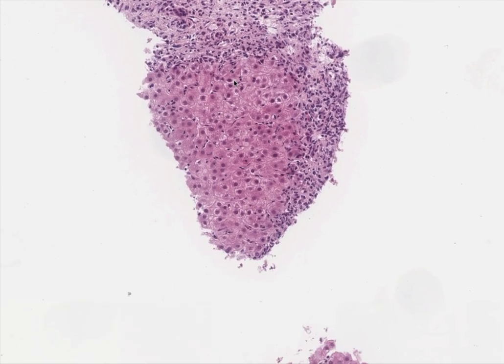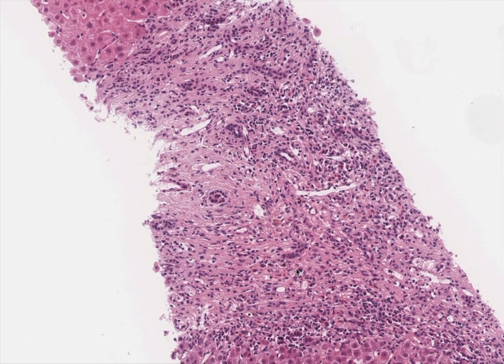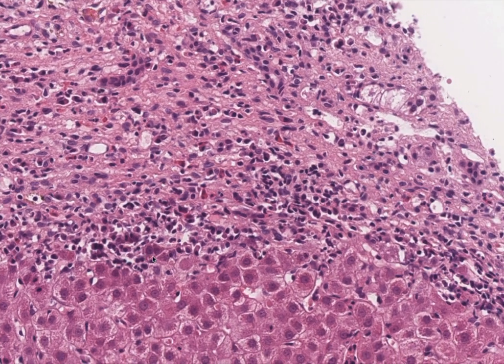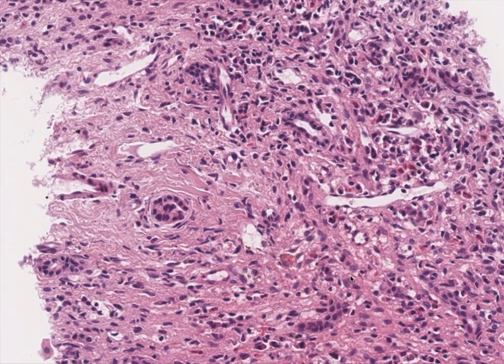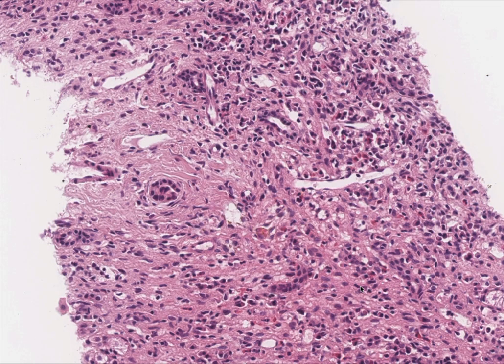Let's continue to have a look at another portal tract, this one here, which is a bit larger. We can see that there's quite active interface hepatitis through here, so it's still an active ongoing process. Interestingly, we've got some eosinophils. We've also got prominent bile ductular proliferation. The existing bile ducts are still present and look intact, and the vessels are okay.